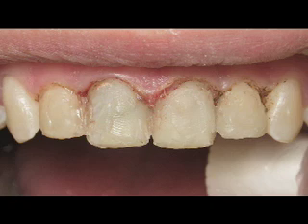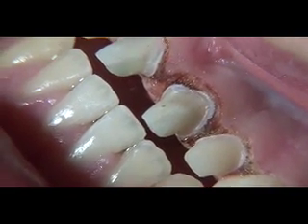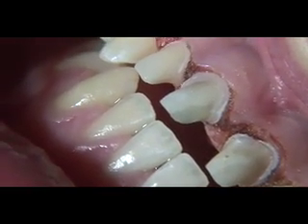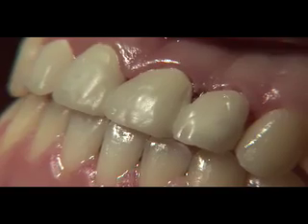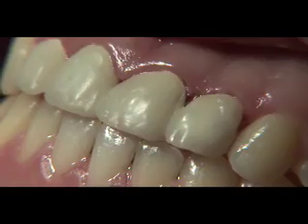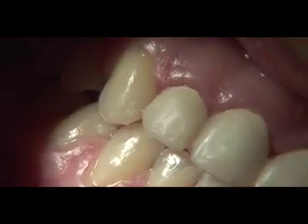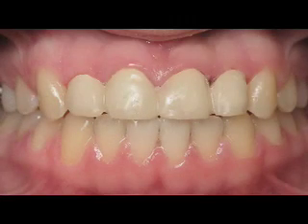Next we prep for full coverage restorations and clean up the gingival tissues ready for impressions. In this case, the size of the centrals and laterals were disproportionate, but that will be corrected with the restorations. Provisional restorations were fabricated with Luxatemp and left in place for two weeks. Oral hygiene instructions included the daily use of floss threaders to keep the interproximal areas debrided for better healing.